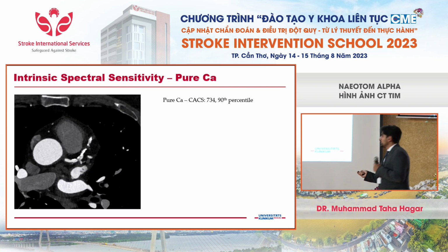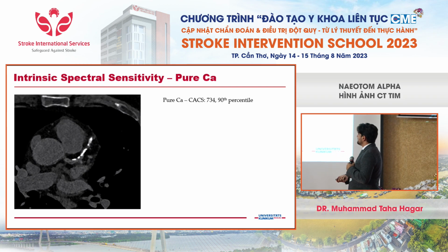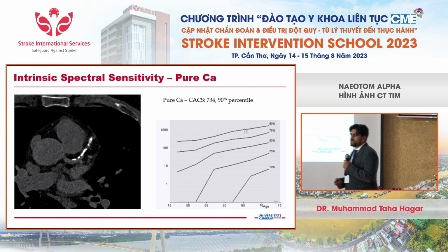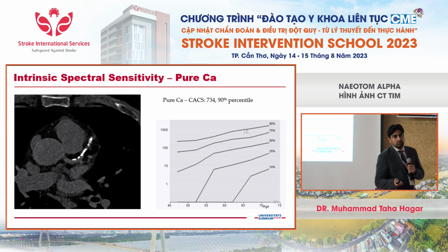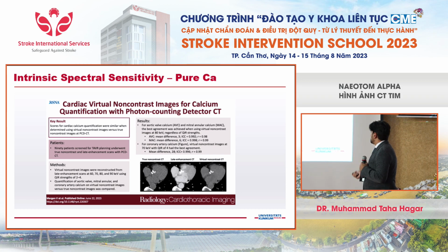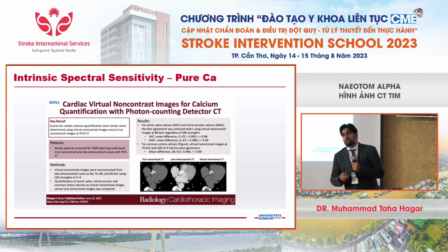And because it's so beautiful, I want to show it to you again. Here you have the iodine, here it's gone. And then you can measure the calcium, and you see there's a slight discrepancy, but the overall percentile of the risk in this patient was similar. And a recent study published by a research group from Zurich showed the reliability of this method in TAVR patients, derived from the late enhancement CT scan they performed there.